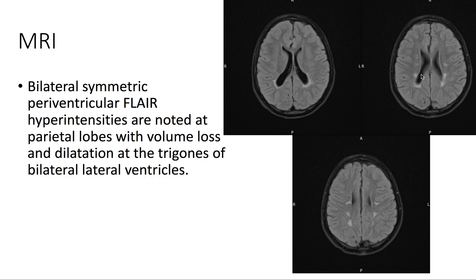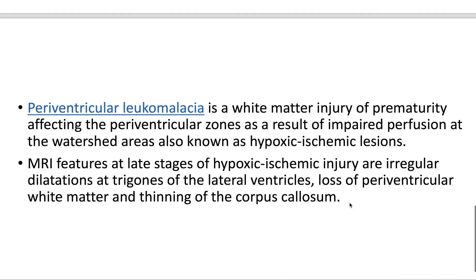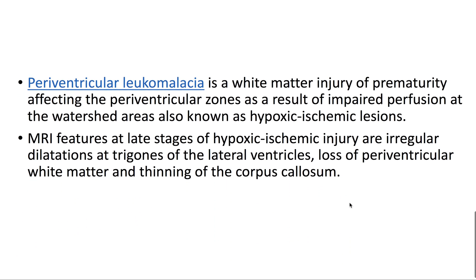Periventricular leukomalacia is a white matter injury of prematurity affecting the periventricular zones, as a result of impaired perfusion at the watershed areas.